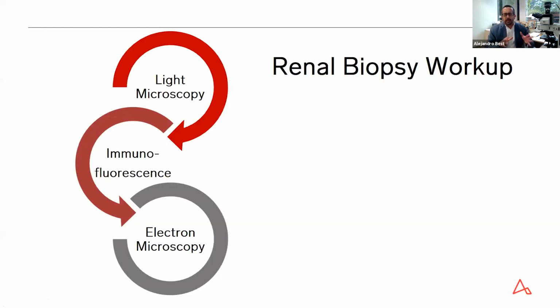Shri did a brief introduction regarding this, but in previous workshops that we've done over the years, we usually focused on light microscopy, and that's a very common approach for these types of sessions. We used to cover the normal morphology of the kidney, and for every disease we talked about, we started from light microscopy, and then showed the immunofluorescence and electron microscopy as ancillary studies.